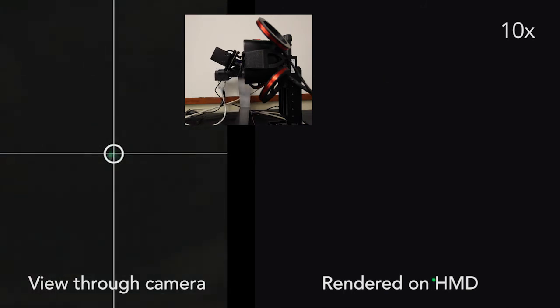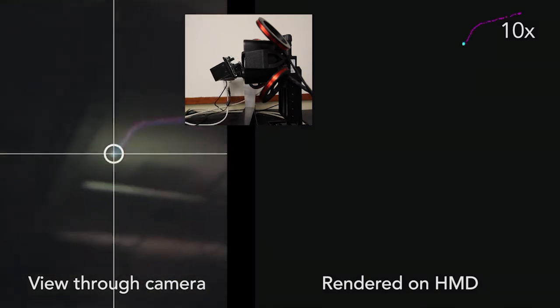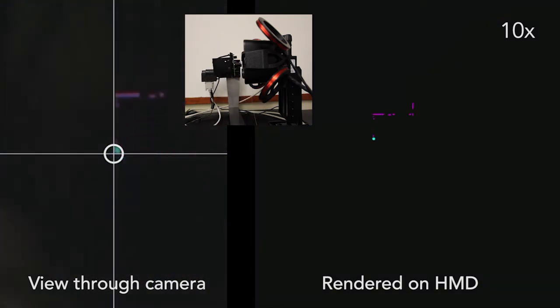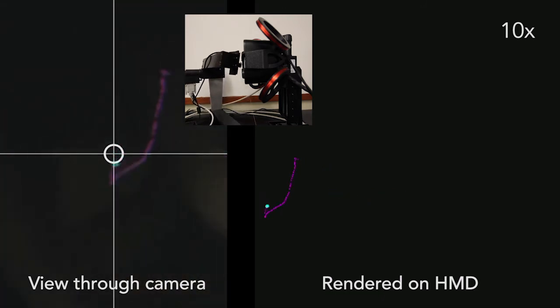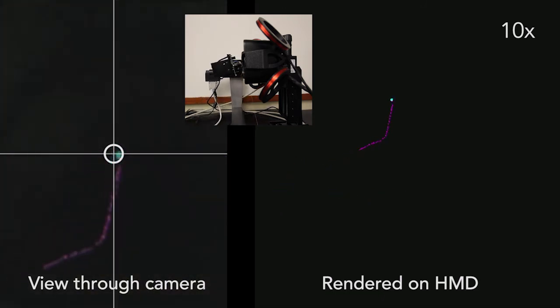In this demo, the test rig is controlled manually. The system looks at each of the 36 calibration points. Once completed, we activate the gaze cursor to show the real-time predictions of the system.